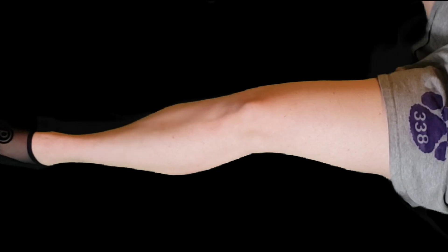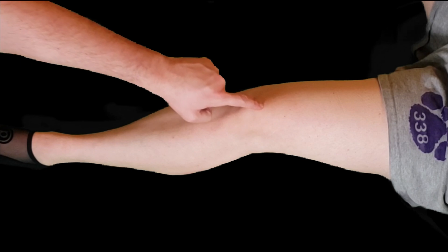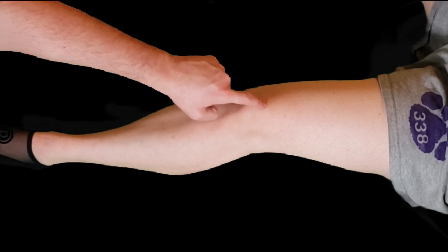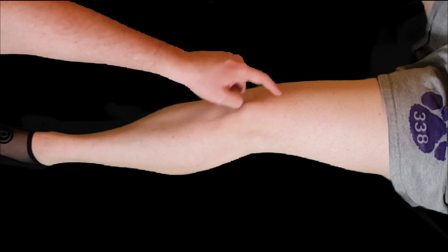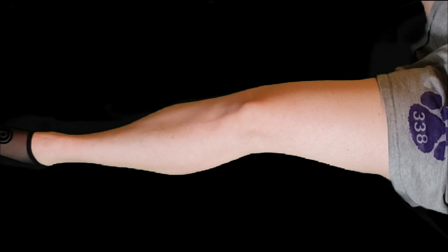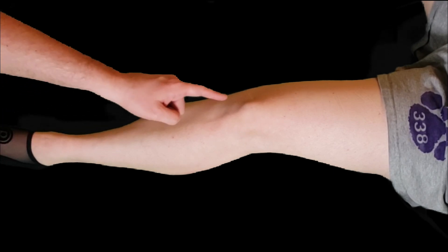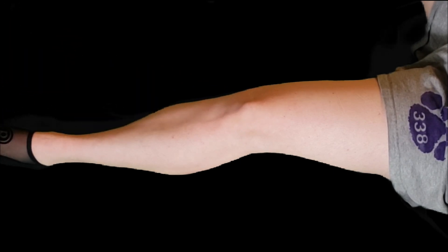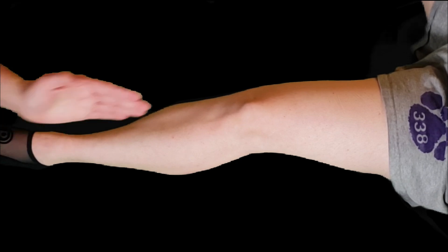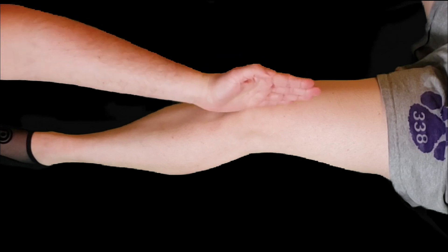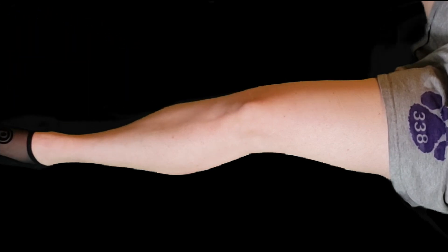We're going to take our ultrasound probe and place it above the patella and evaluate the suprapatellar notch. The marker dot is going to be pointed towards the patient's head, and we're going to have the ultrasound in a sagittal plane on the knee.